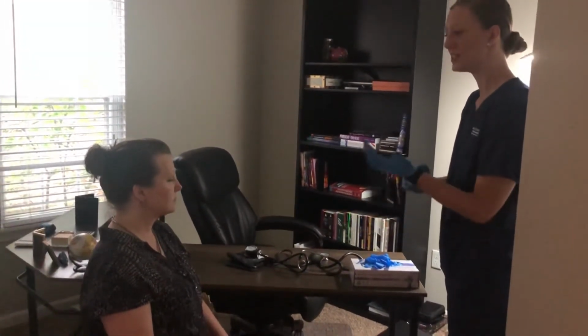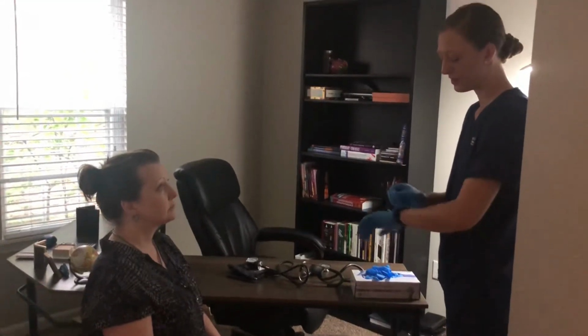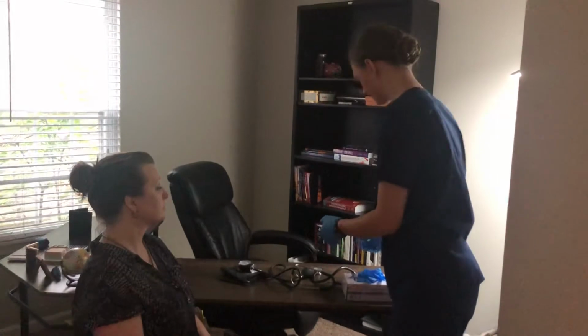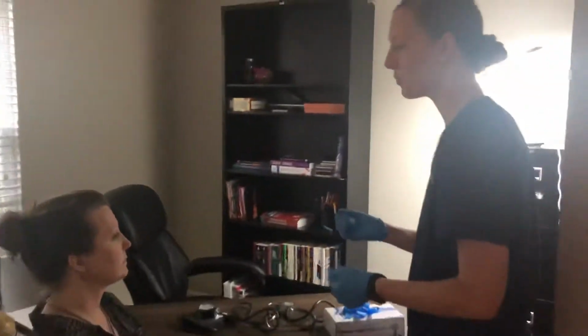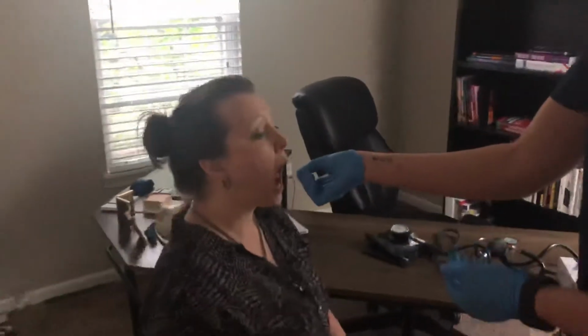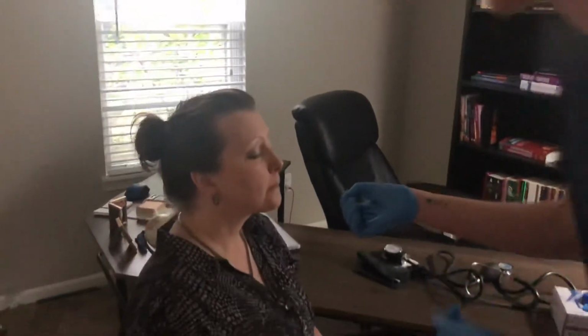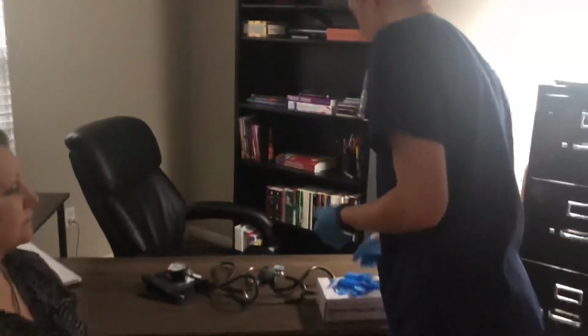All right, first I'm going to take your temperature. So I've gathered all of my supplies. We're going to do an oral temperature, so I want you to hold this under your tongue and close your mouth. The normal ranges for an adult temperature are 35.8 to 37.3 degrees Celsius. All right, thank you very much. I'm washing the temperature probe.